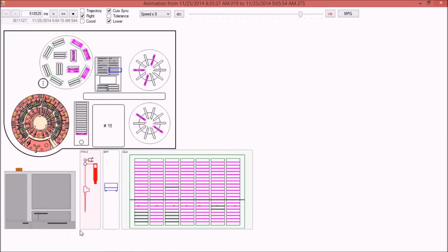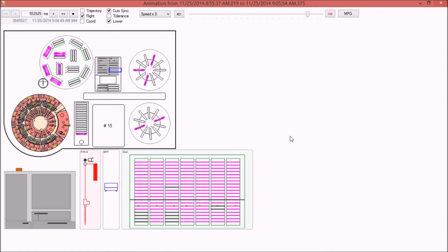This other part is a front representation, of course a symbolic front representation of the instrument, having all the doors that can be opened and closed to let the user make all the manipulation he needs. And this is a light emitter that closely resembles the real situation. So if there is at the client side, at the customer side, a problem that turns into an alarm changing the color of this light, you can simulate exactly when this happened and consequently try to find inside the log files what's the situation.